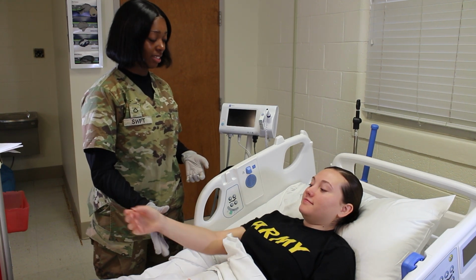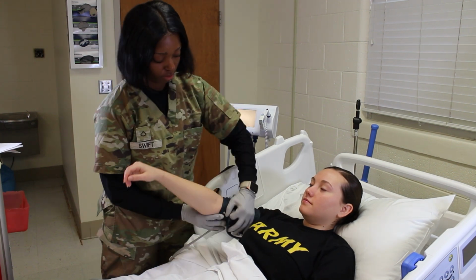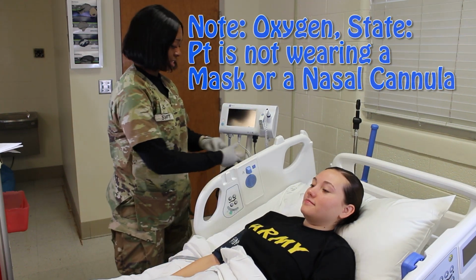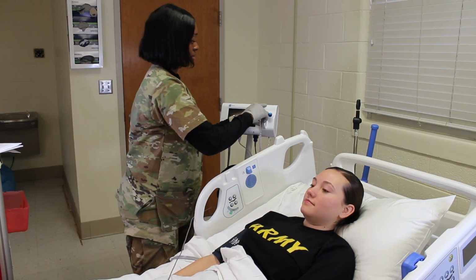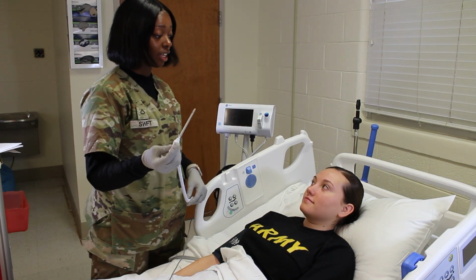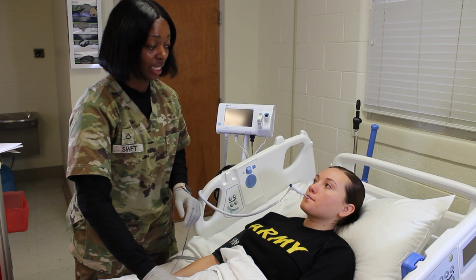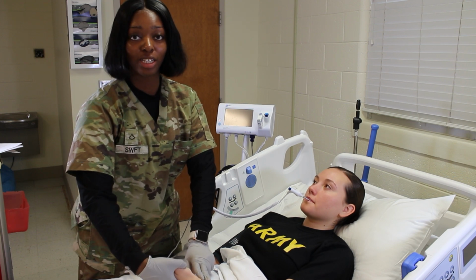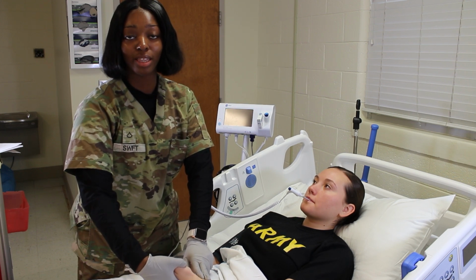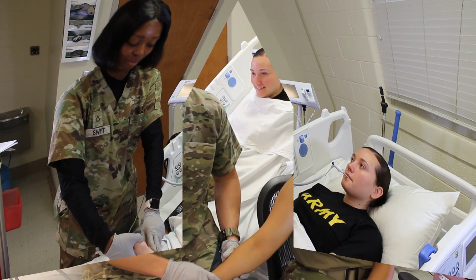Could I see your arm, please? Thank you. Perfect. Can I see your other hand, please? Thank you. All right, I'm going to stick this temperature probe under your tongue. Could you open up for me? Thank you. And I'm just going to check your pulse with this hand, okay? Although I told the patient that I'm checking her pulse, I'm actually using this time to count her respirations and monitor the rise and fall of her chest.